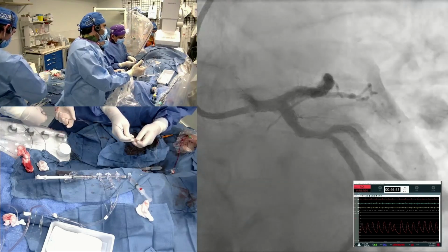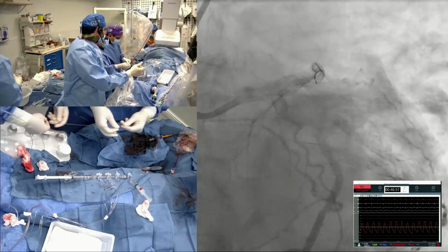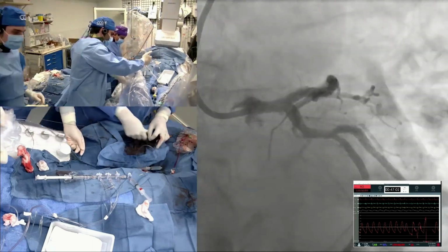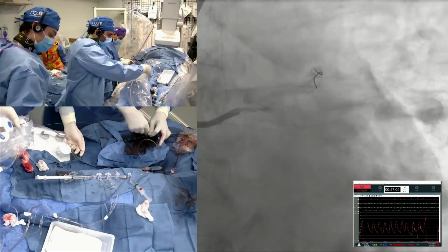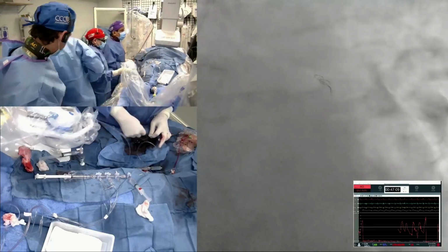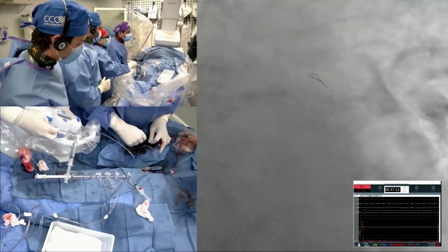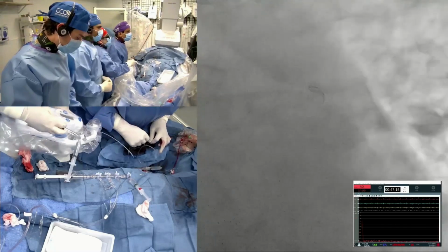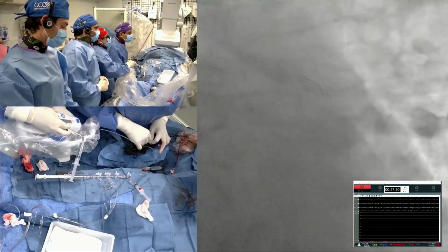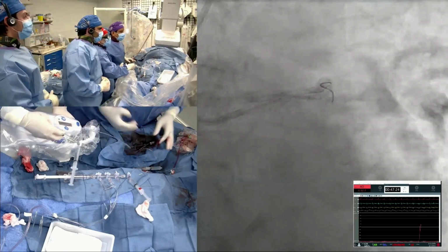Looks great, though. Very nice. Looks a terrific result, and clearly the bifurcation, or the crux of the bifurcation, looks very, very good. Okay, I think we are just doing it for the completion's sake now. You're right. You don't need any IVUS or so. Angiographically looks very good. We have done whatever we need to do by all the books, in terms of calcium modifying strategy, all have been done in this particular case. And now we just do a little bit of good. I think that's okay. Show the IVUS on the screen.